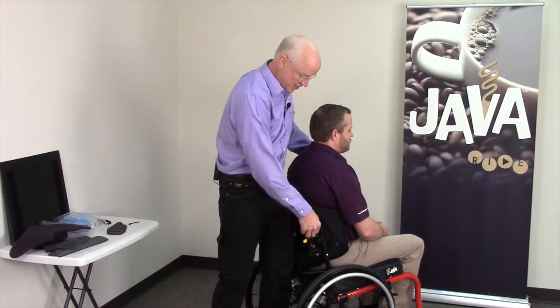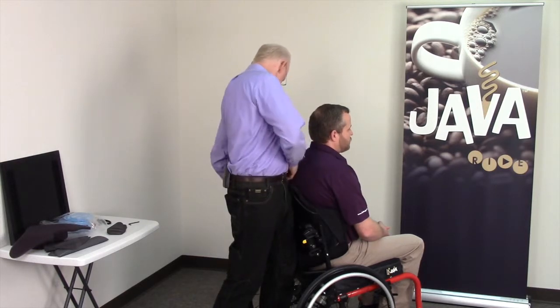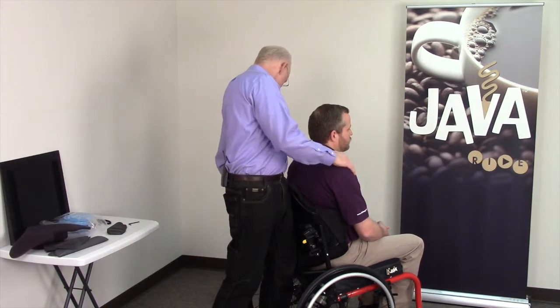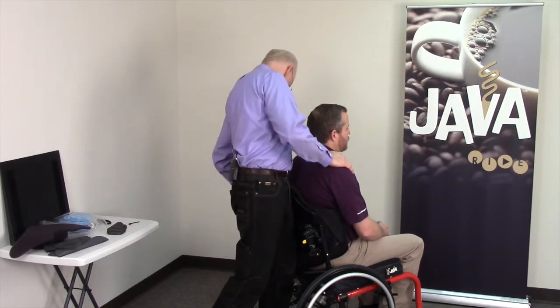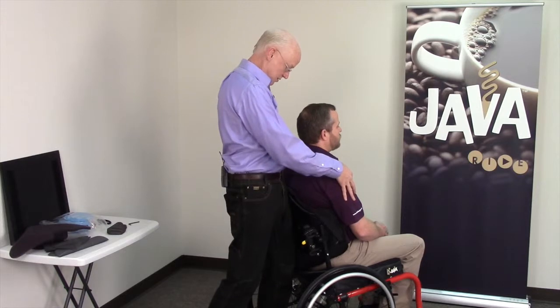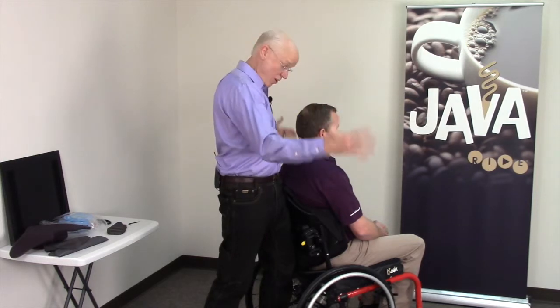Again, my client is safe. I'm loosening up my back angle adjustment, both sides. I'm spotting him, letting him know, Ryan, you're going to feel the back move here in a second, all right? Now, I can just move him. Isn't that nice? How's that feel? About right there? Okay, so now I've got no hands on the hardware.